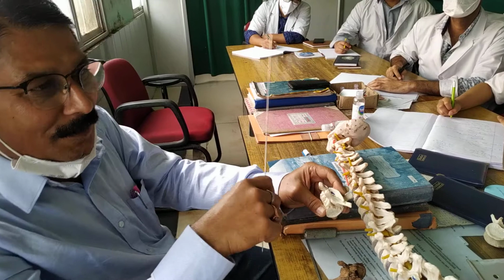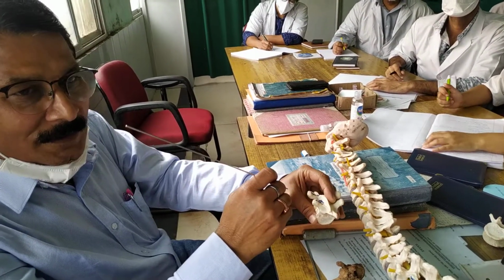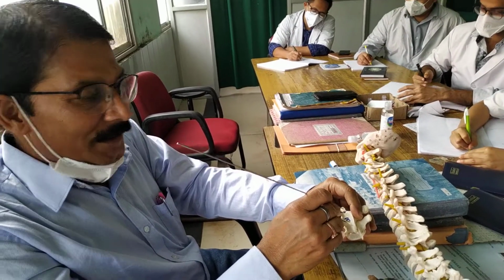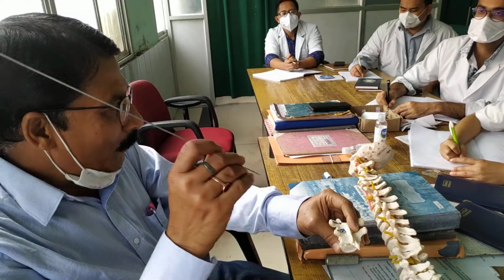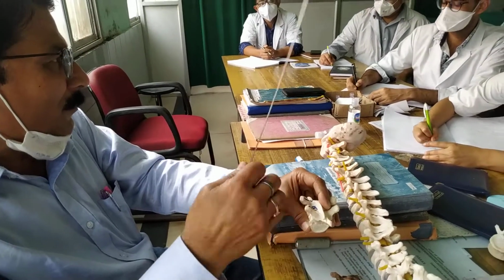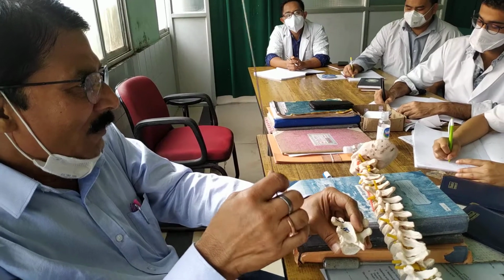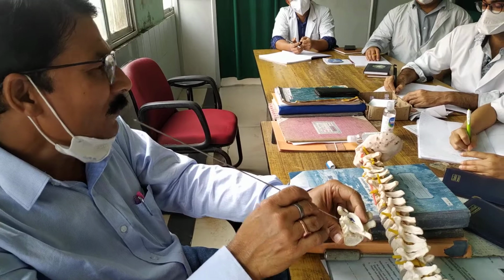And the technique is also the same. You have to de-roof it. Find out your entry point, then de-roof this cortical part. Take the pedicle finder and use the gear shift technique. Concavity on the outer side, convexity on the medial side. Go up to the distal 1/3, not beyond that.